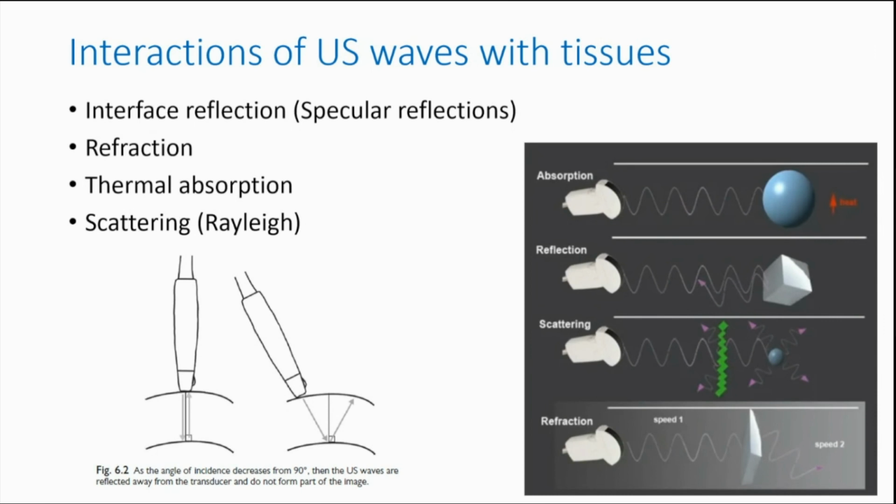For example, with real-time ultrasound-guided spinals, the curvilinear probe is curved, but the needle goes in a straight direction. So the needle itself is not as well visualized because of the nature of the insonation. But in that case, you depend a lot on tissue movement.